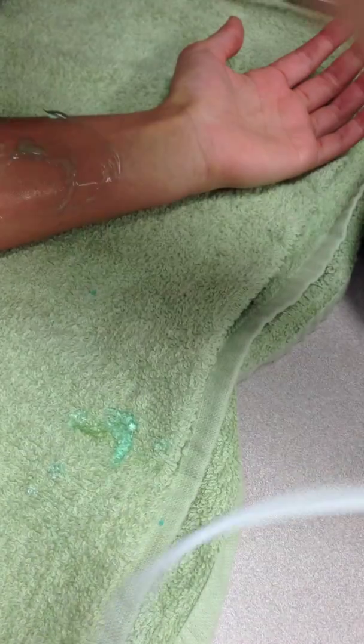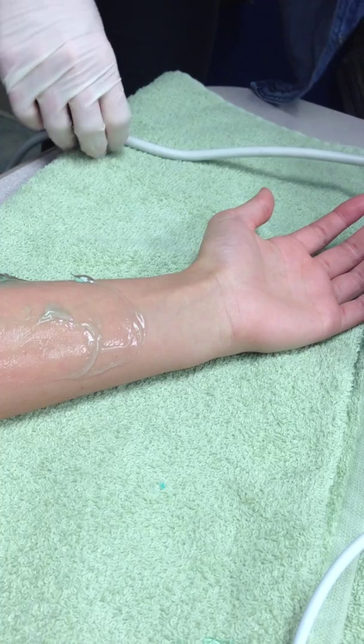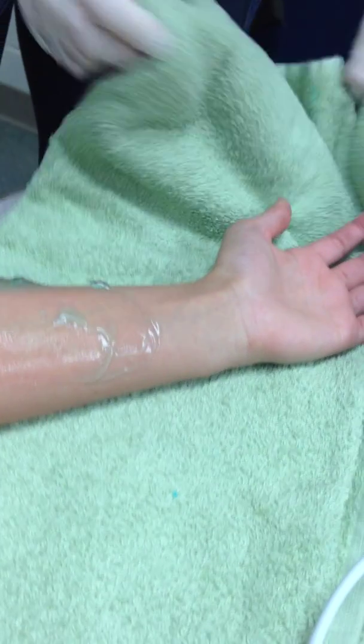Then you want to wipe off the transducer and then clean the patient. And then you would move on to occupations.